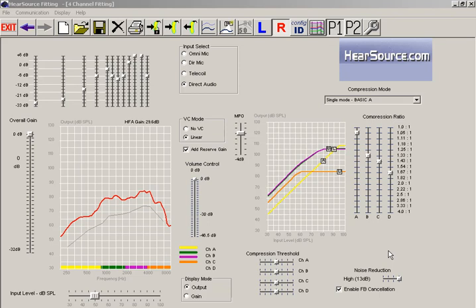Hi there, this is Aaron with Hearsource.com. Today we're taking a look at the Hearsource fitting software. This is the software that we use to program our hearing aids.